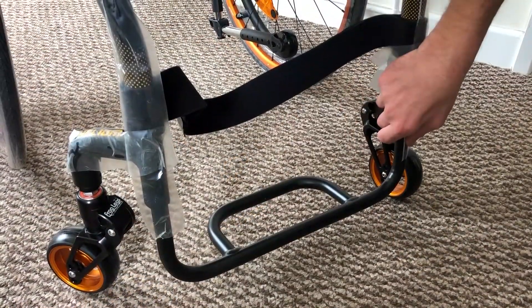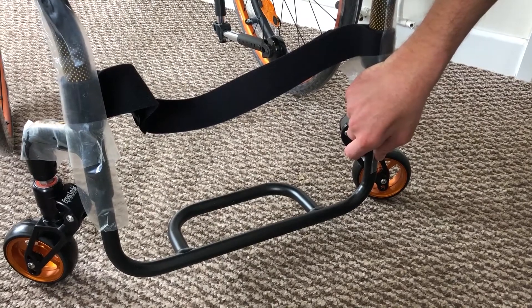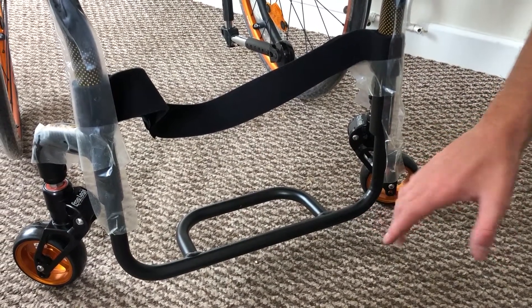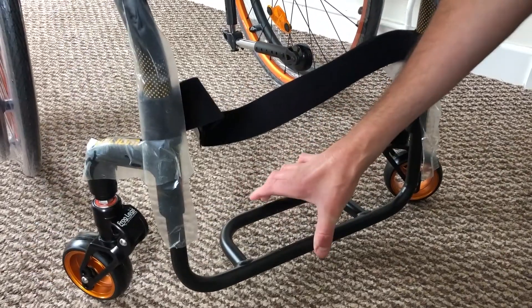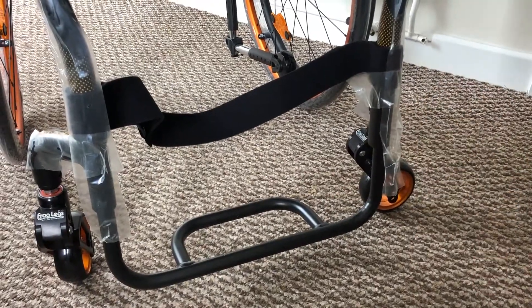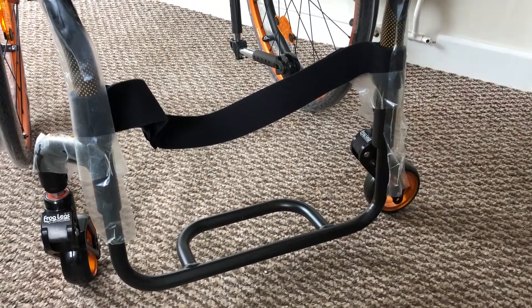Here we have the D-section tubular footrest, which is perfect for the FreeWheel. The customer has also opted for the FreeWheel, and this is the ideal type for it to clamp onto. It also gives you the stability that you need when sitting with your feet positioned.